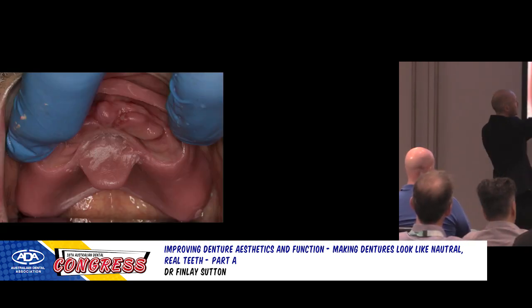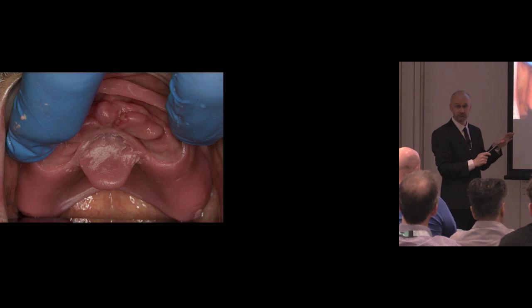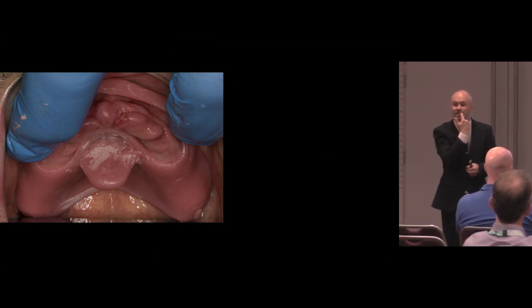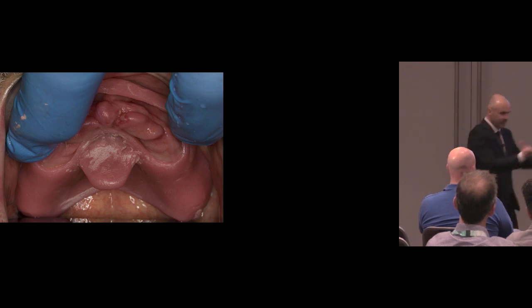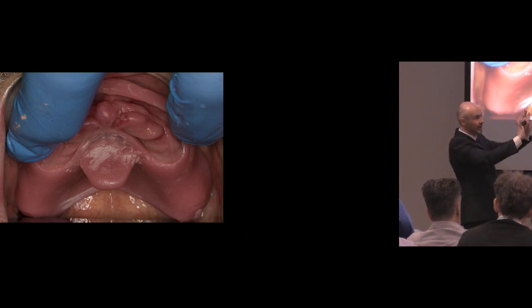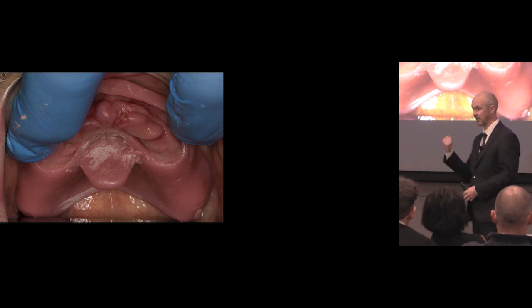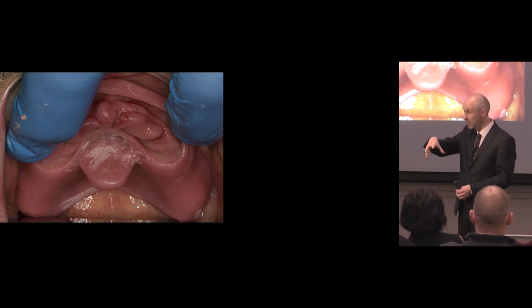We've got a window tray with this flabby material here. Prior to doing this, I've done an overextended primary impression to enable me to produce this special tray that's got a window in, it's got a border that goes into the sulcus, and then the flabby tissue just hangs through there. Because if I make a denture to fit onto that, conventionally I'm going to squidge that tissue, squash it, and then the denture will just want to push it down, and we need to scoop out loads of relief on that. So in order to get around that, particularly for really wobbly ones, rather than just putting tin foil on the model and putting a spacer, I do a window.